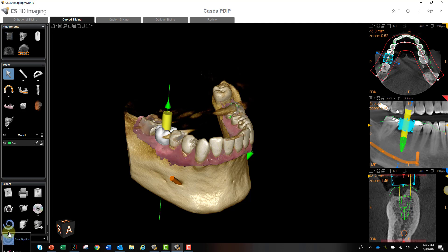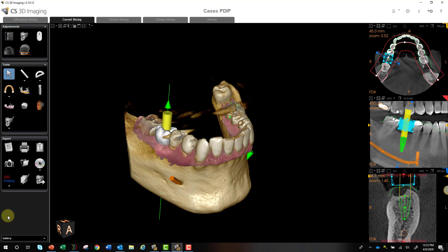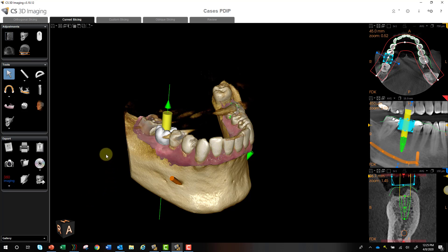Using the drop-down arrow reveals more icons that may be pushed off the page — make sure you close the toolbars so the export box is fully visible. From there, you can export the plan to Swiss Meta for a unique and effective surgical guide, or to 360 Imaging, a guided surgery company. Using 360 Courier, hitting that link will launch 360 Courier, let you fill out your Rx, and send the case directly to them. They'll fabricate the guide and send it back — all done directly from the CareStream software.